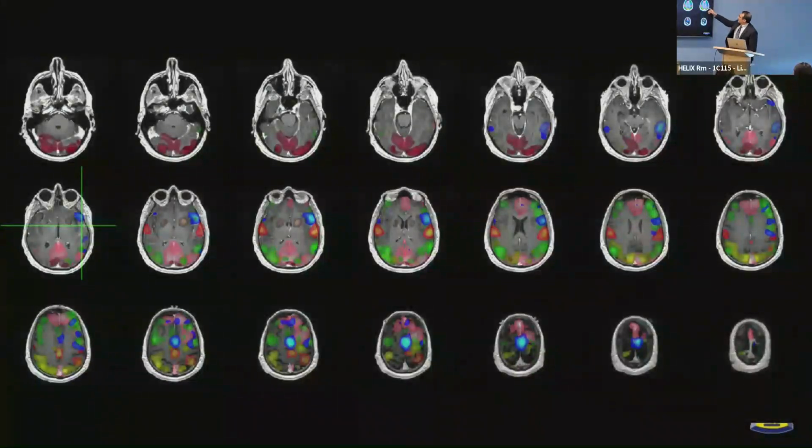But now, let's say there's a lesion here. Where's the access point if you want to try to avoid damaging any of these networks? Again, we don't know what happens if you take out the left parietal part of the attention system, but I guarantee you something is happening to the patient because that part of the brain is doing something. It's just that we were not able to measure it properly before.